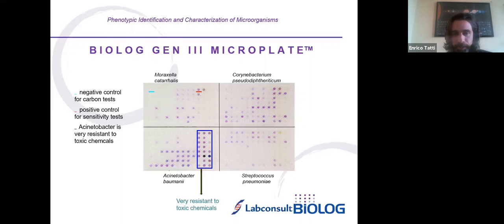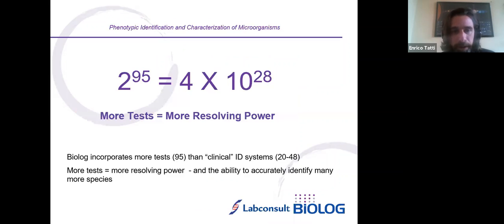Together with this plate, Biolog has prepared a database. The results you obtain with your bacteria, which maybe you don't know what it is, are run against the database, and the database will find a match, if there is one, and tell you the ID. And that's how simply it works. It requires a plate, and it requires software and a reader, which I will cover in a moment.